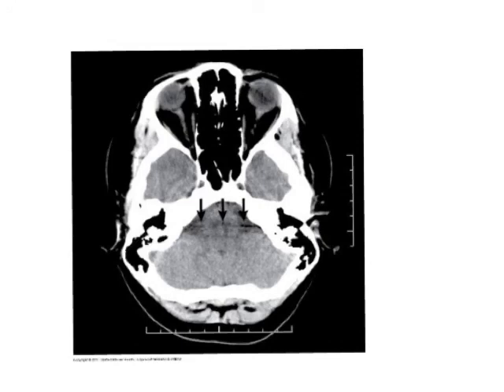The brain is the same way. The skull is hard on the outside, and it's full of soft and gooey stuff on the inside, right? So when the CT samples that, it's hardening the beam. Only the really, really high energy X-rays are getting through the skull. And then when they hit that soft tissue, they don't know what to do with it. And then they have more hard skull to go through. So especially at the base of the brain, the base of the skull, we see beam hardening artifact. We saw it earlier with the arms too, because the bones of the arm had hardened the beam.